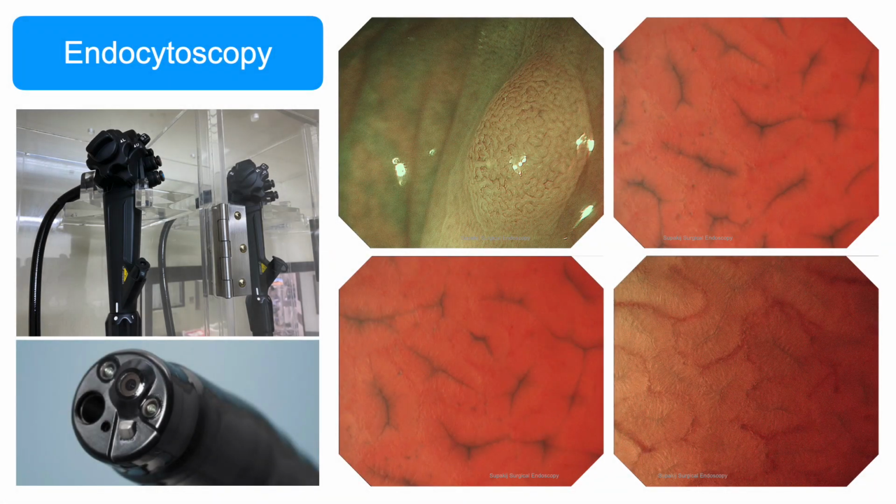Endocytoscopy is available for more additional information to make a more accurate diagnosis.